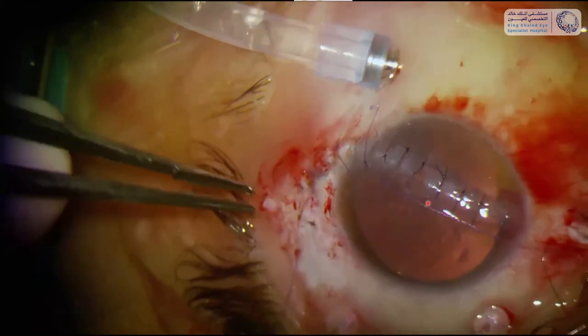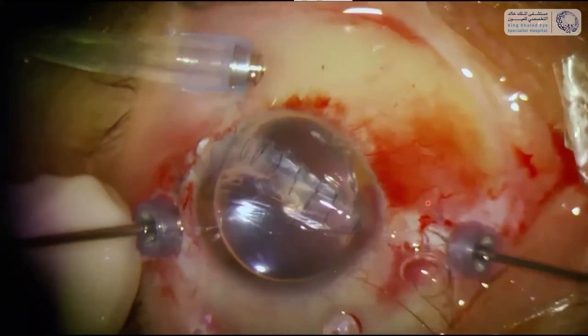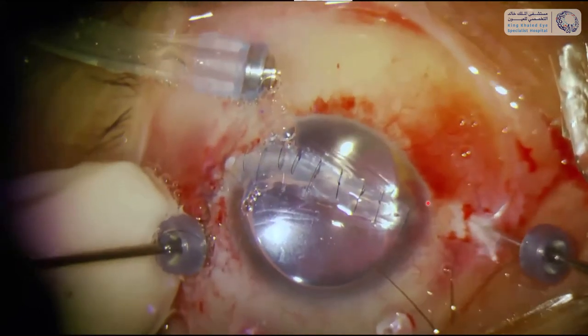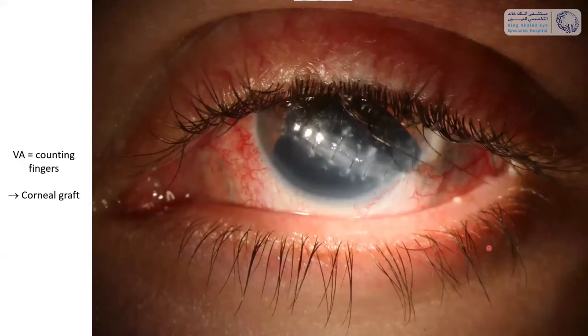After another half hour we ended up with a closed cornea. I then inserted cannulas into the eye, carefully shaving the vitreous base in flow mode with the EVA, followed by an injection of air. The retina was still attached, and in the end we injected silicone oil into the eye, which I usually do in trauma cases. We closed the eye and ended up with a visual acuity of counting fingers.